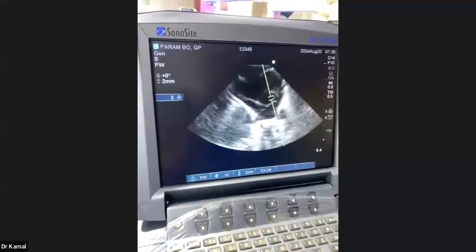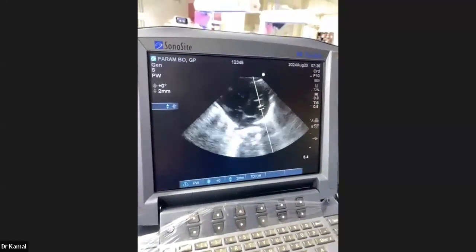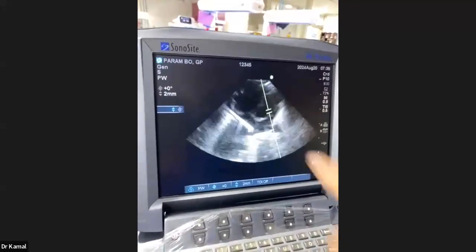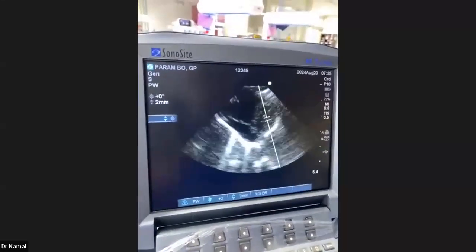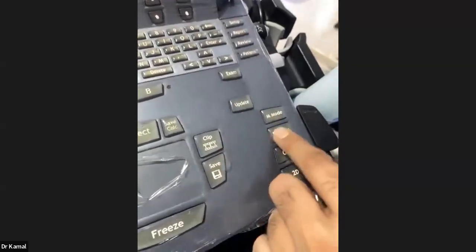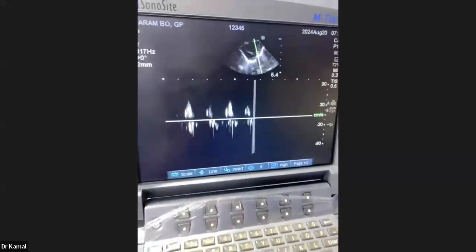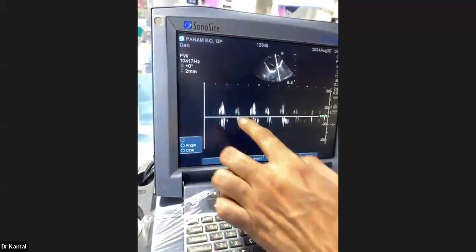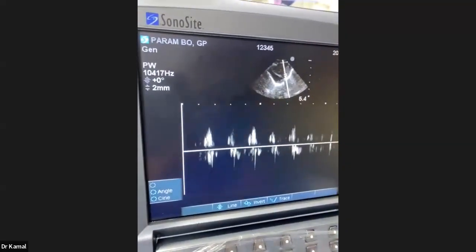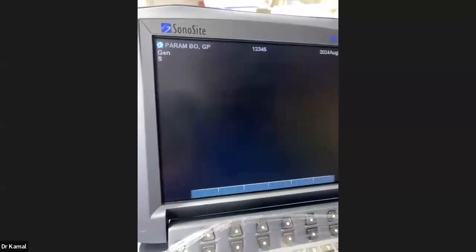Dr. Sarjan told you yesterday why it is called a pulse wave Doppler. He explained it in mathematical terms and physics terms also. So if I press this pulse wave Doppler again, come over here, this button or the update button, any of them, something will come over here, which is like this. So these are something like E and A waves or some other waves coming. So this is pulse wave Doppler at this point. I'll show you a little better image with this.